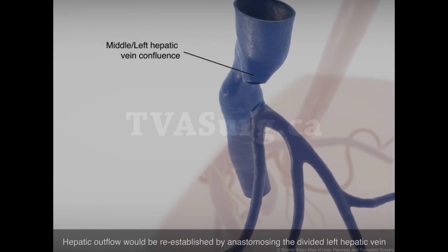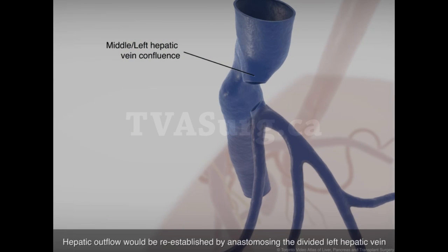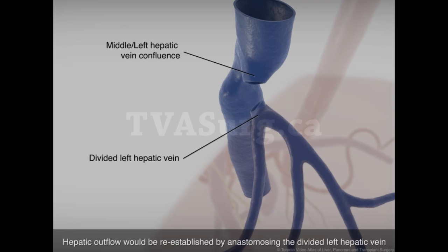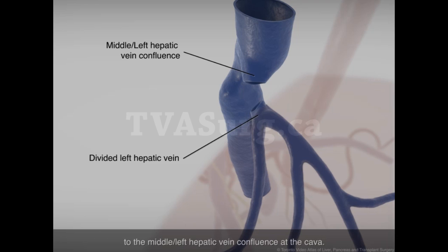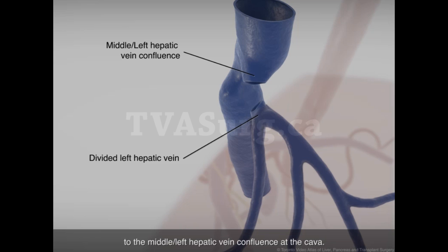Hepatic outflow would be re-established by anastomosing the divided left hepatic vein to the middle left hepatic vein confluence at the cava.